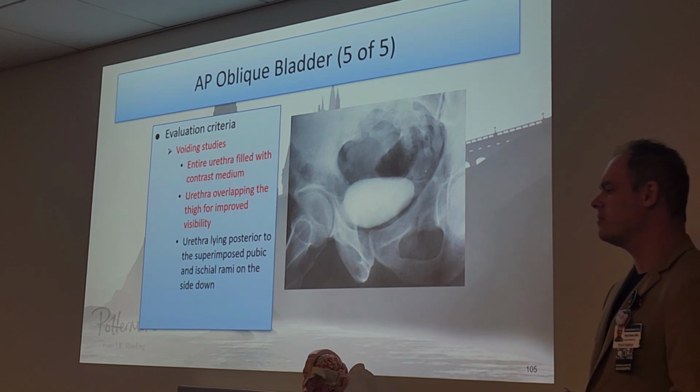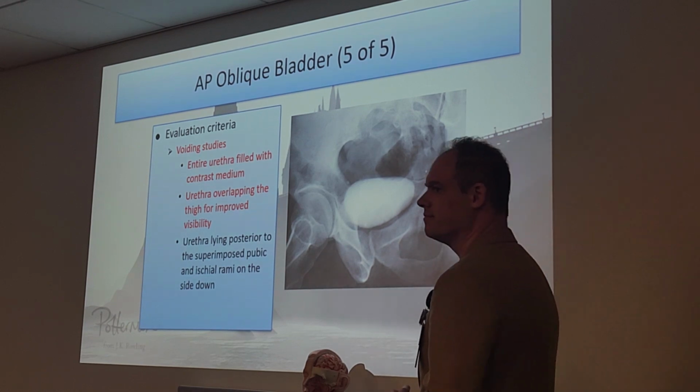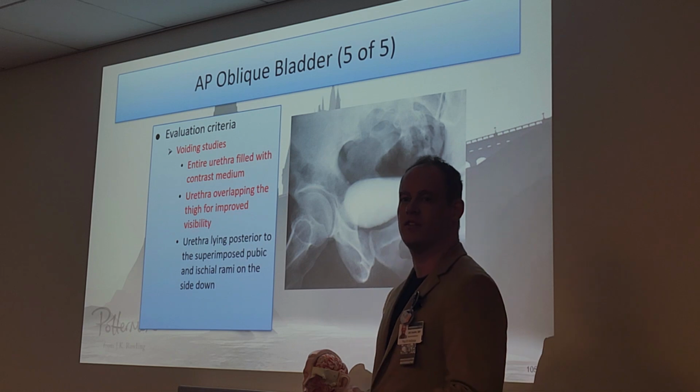And you can ask the patient to do it for you. You don't have to necessarily do it for them unless they're unable to. Positioning them? The positioning of the organ, yes.